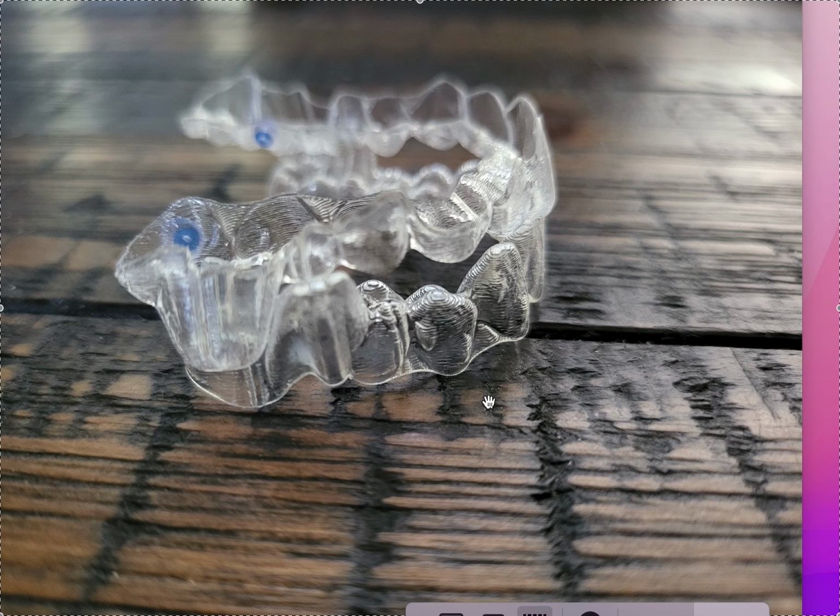So first of all, I would not do Invisalign with MA until you have done some Invisalign cases, because it's a little bit trickier. And I feel like there's a lot more variables, so you might get confused. So do a few regular Invisalign cases first so you can get the hang of how Invisalign works. And then you can do an Invisalign with MA case.